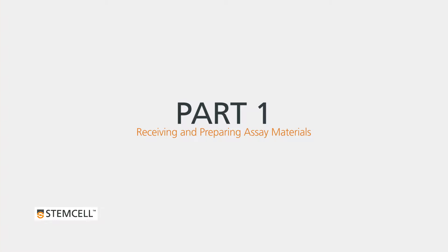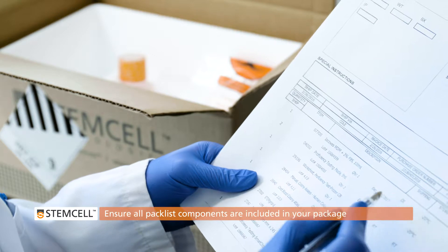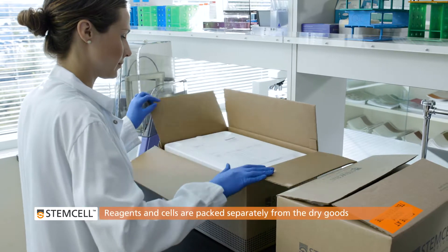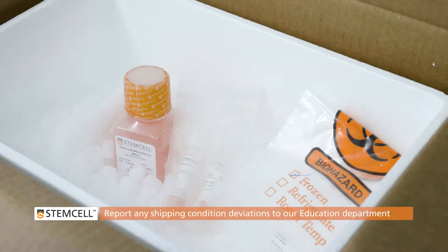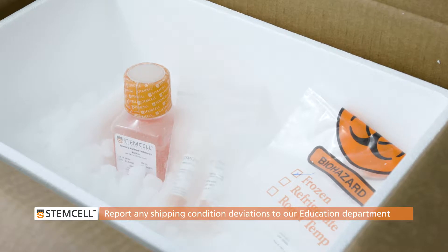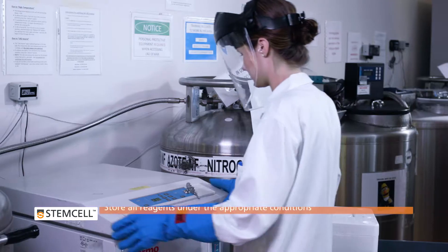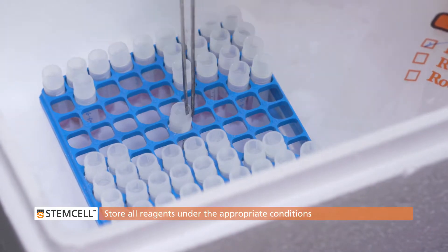Part 1: Receiving and Preparing the Assay Materials. Open your course package upon receipt and ensure all components are included as indicated on the pack list. Reagents and cells will be packaged in a styrofoam container separate from the dry goods. Any deviation from the shipping conditions should be immediately reported to our Education Department. Store the reagents under the appropriate conditions, as failure to do so could drastically affect performance.